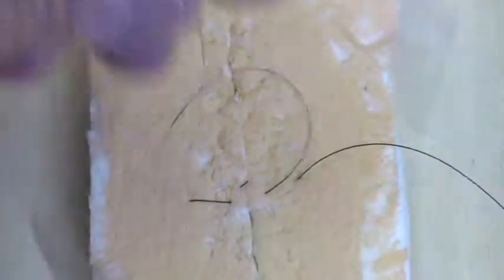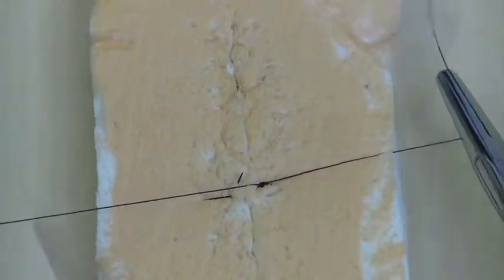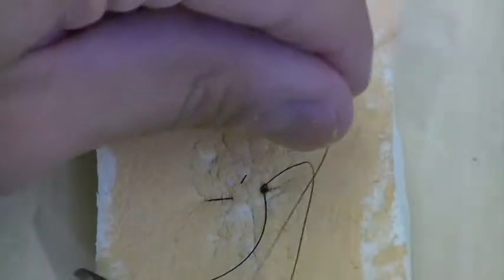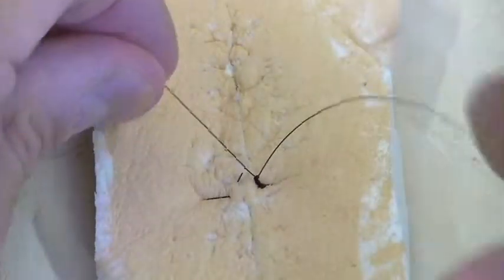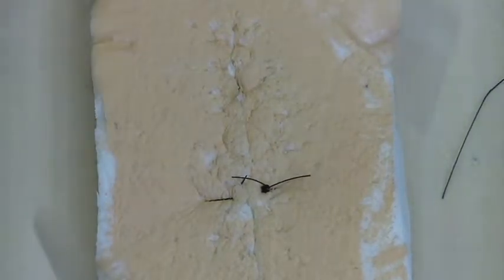And then we're going to go here. We can do our surgeon's knot if we want. Got to give it twice — one, two. And then one, two, three, four, five, six. If you're using nylon, instead of doing seven throws, which is six knots, you'll do five throws, which is four knots. And we just cut it about half a centimeter short.